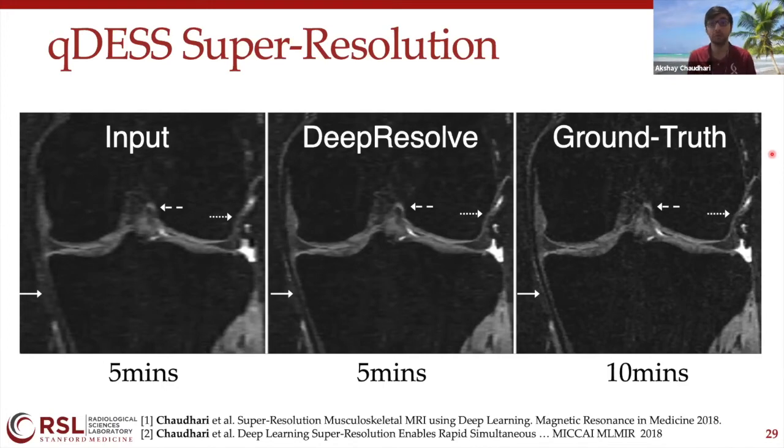And then just doing validation studies in large populations will be important. We have some preliminary studies in 30 subjects and 50 subjects, but to get real clinical adoption, I think it'll be important to do studies at multiple different sites that see different demographics of patients and just really be able to scan more patients to see what the overall efficacy is. So that is the ultimate goal, and that is what we're slowly but surely trying to transition towards.